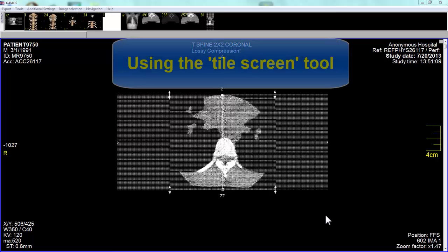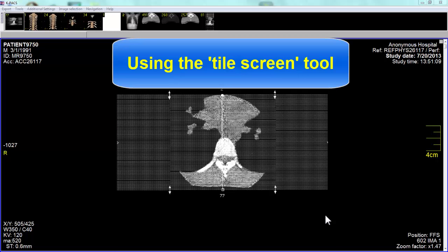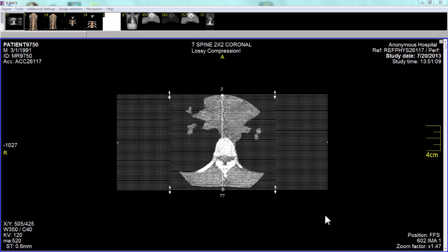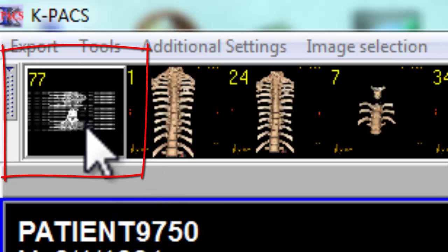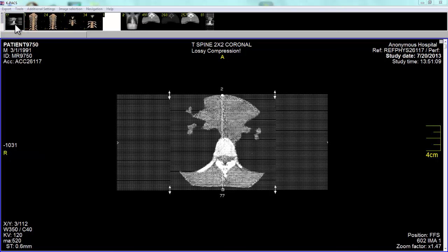The purpose of this tutorial is to show you how to use the tile screen tool. Typically, when you first load a CT study into KPax, you'll only see one image displayed, and this image will be the first image in the first stack to the left. In this tutorial, I will show you how to display multiple images at the same time.